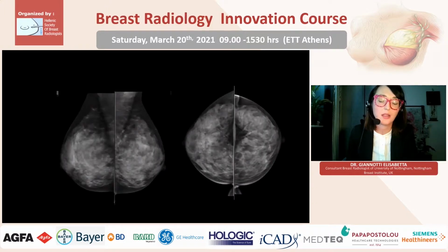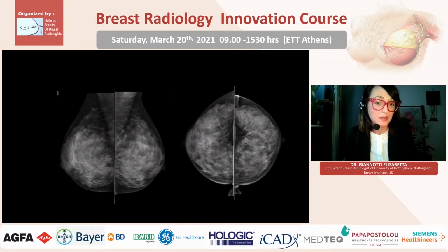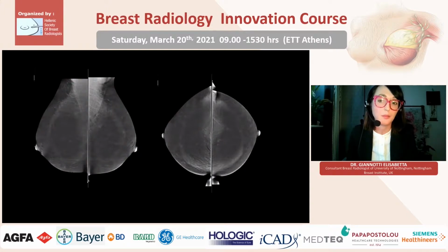And also, I think it could be very helpful in increasing our confidence of normality. If we see a breast like that, I say, well, yes, they're very dense, but the power of a mammogram can be 50–60%, so we can miss things. But if we move to the recombined picture, the absence of a focal enhancement, and knowing that the negative predictive value is high, can increase our confidence of normality.